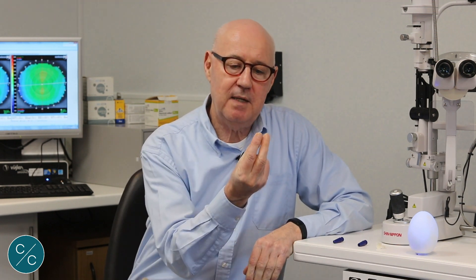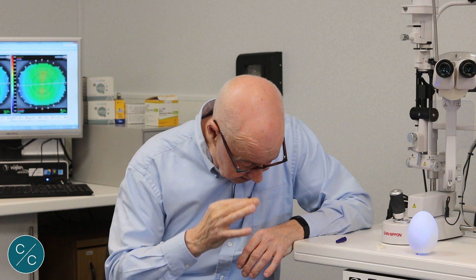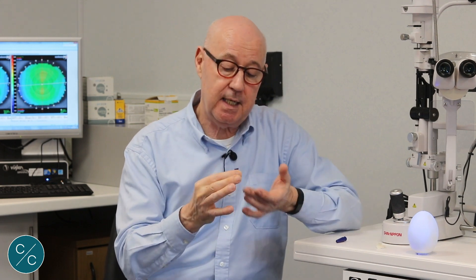Whereas normally we would advocate using the tripod method for inserting lenses, some patients and practitioners still prefer to use the traditional scleral sucker. This can be trimmed to remove the bottom end so that the patient puts the lens onto the sucker and, as they look down as they insert the lens, they can actually see light through the bottom of the sucker.